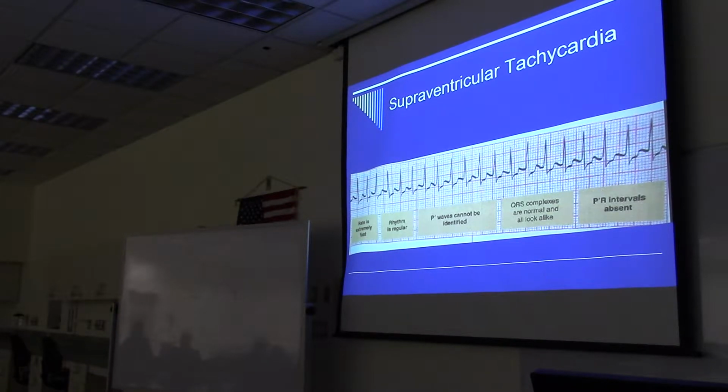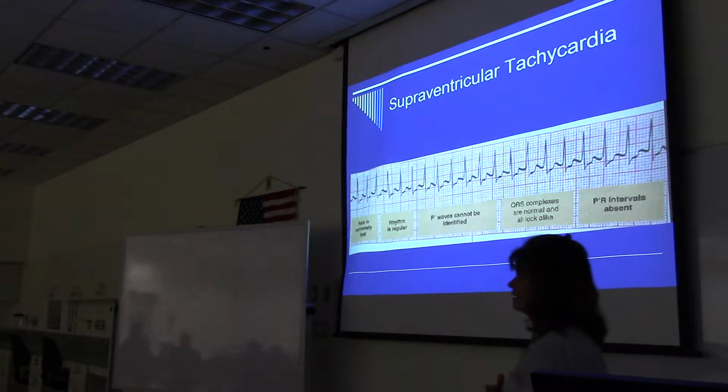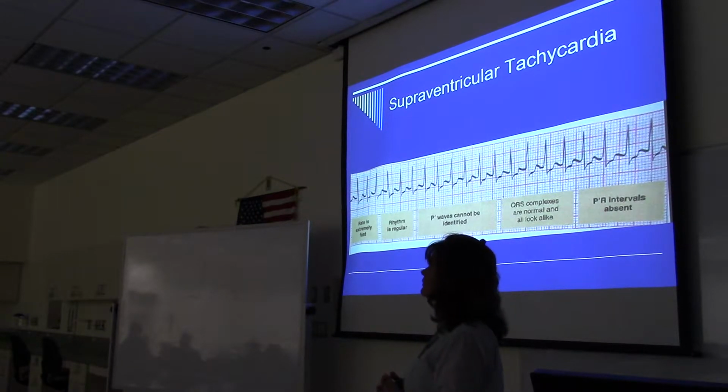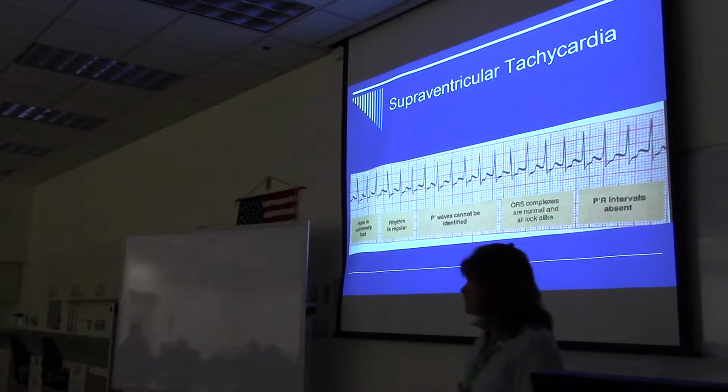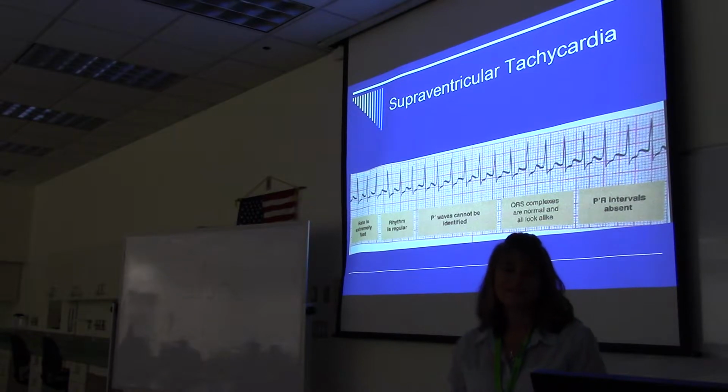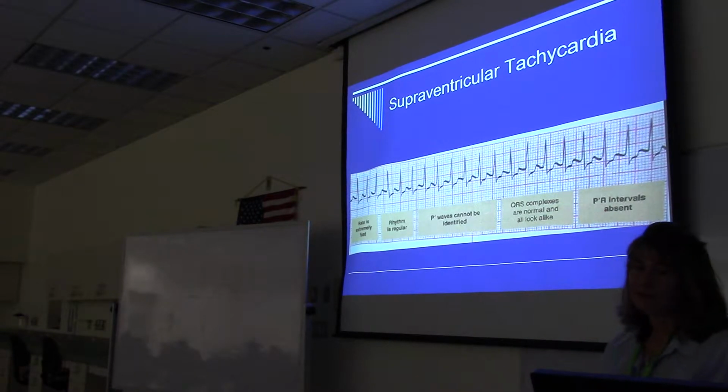That's really fast. Do you have questions, Brandon? If the rate is above 250, would it still be considered an SVT? Yes. Can it go faster than 250? I guess with maybe babies. All right, so really fast heart rate.